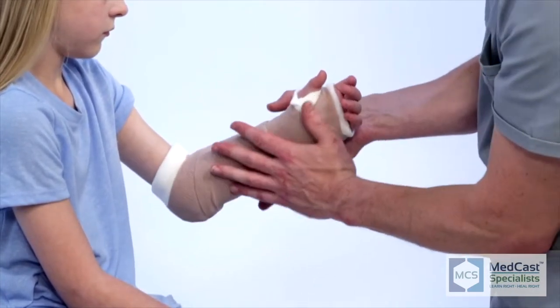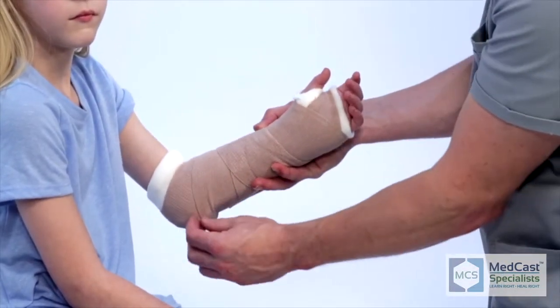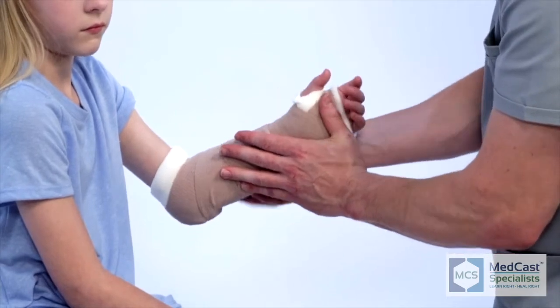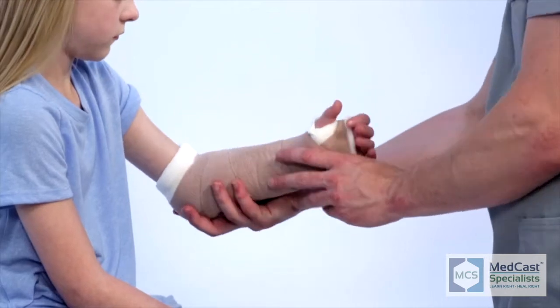Sometimes with a three-point mold you're going to need someone to come help you — a third hand — to achieve that three-point mold. At this point, check your finger motion, make sure they've got good capillary refill, and you're good to go.